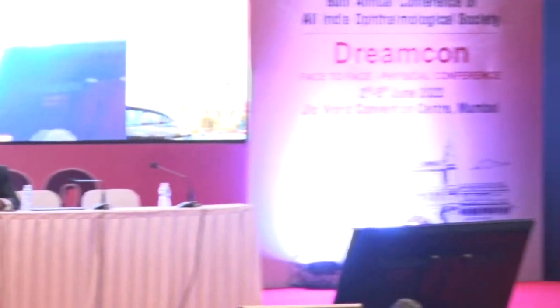Thank you, sir. Basically, when the patient is getting tamsulosin, stopping the drug doesn't help. This is the experience. But if the patient is continuing, it is better to stop it for a few days. But we must counsel the patient. This is very important, that the surgery might need a longer time than usual, and we might use some devices to make it visualize and properly implant the IOL. And we also think that there could be IFIS, and we need to have the operation room ready, that we will manage this patient and this pupil with my phaco parameters, my staff, and my instruments, keeping it ready. Thank you.